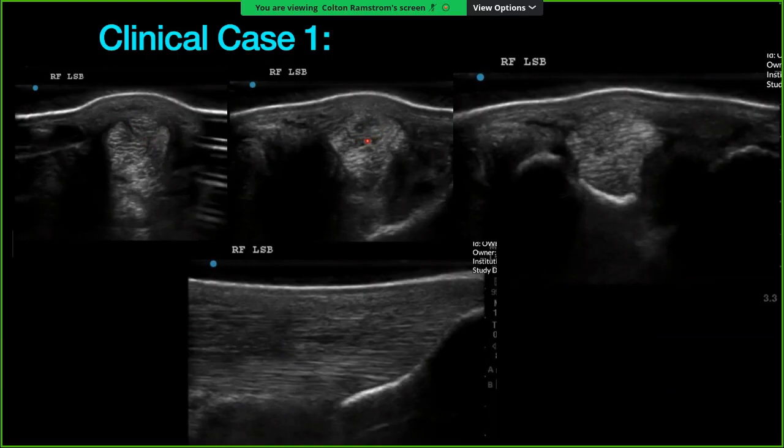As we continue a little bit further distal, we can see a couple little pockets where there are actually some hypoechogenic core lesions, and we still have those fissure lines there. And then distal towards the proximal or apical aspect of the sesamoid, we start to get a little bit more normal fiber pattern, but we can still see a little bit of periligamentous fibrosis here, not bad.